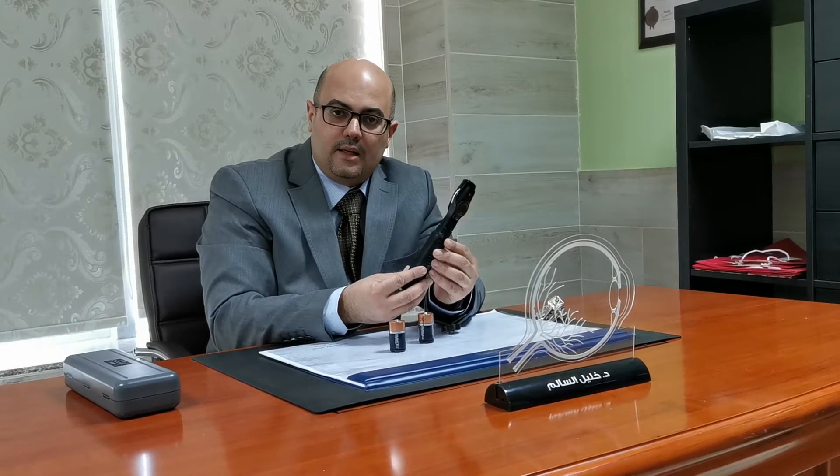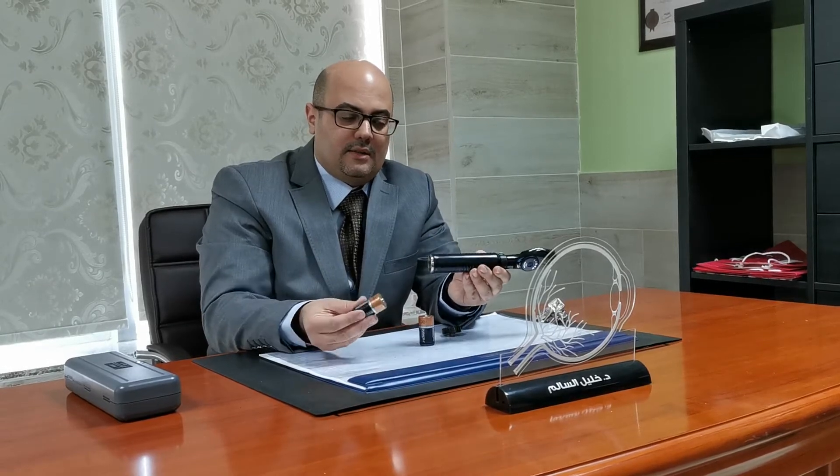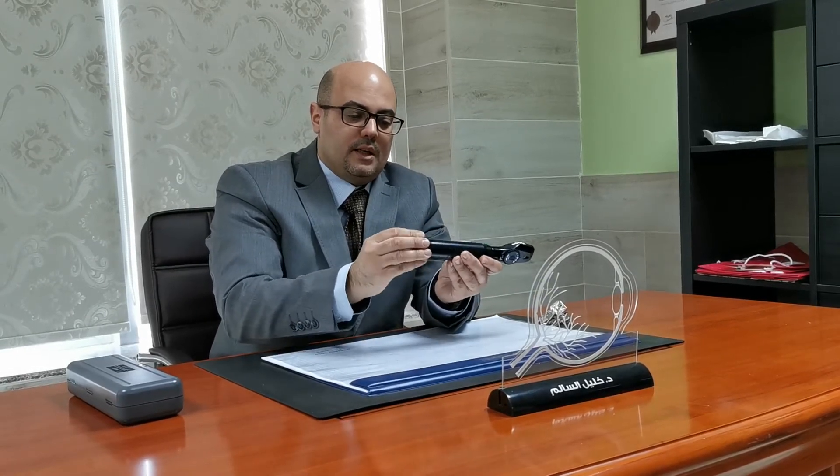To give you a briefing: first, we put an energy source in the device. You can see the green button here. To operate the machine, you press the red button and then flip the handle, and voilà — you have a light source. This is how you operate the machine.